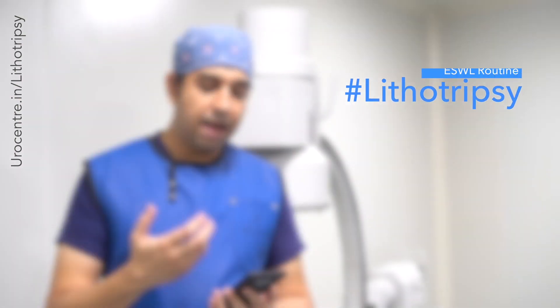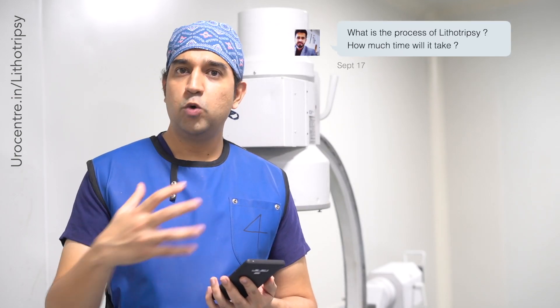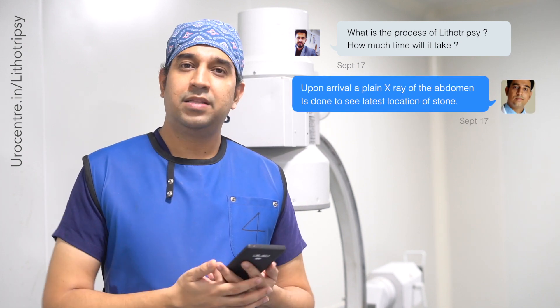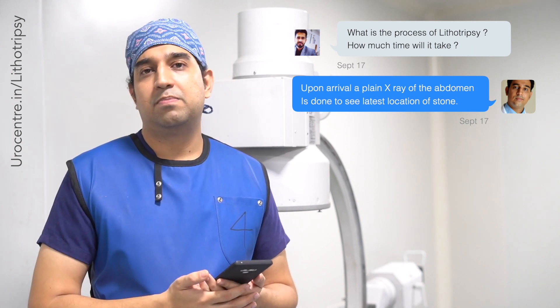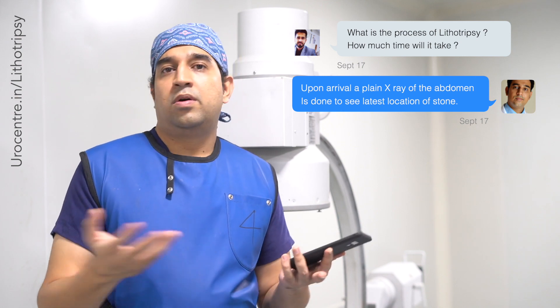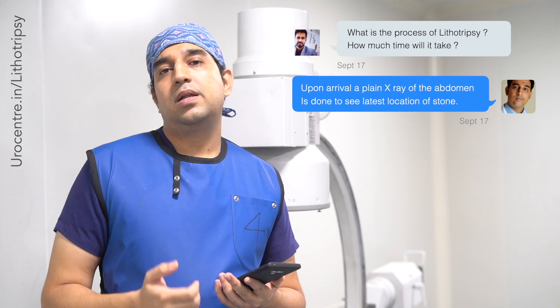What happens when you come for lithotripsy? In the morning, we get a fresh x-ray of your KUB region — the abdomen — to see the location of the stone and the state of your bowel gases. It is important that there is not much gas in the abdomen before lithotripsy, so we give you some tablets to take beforehand to reduce the gas.